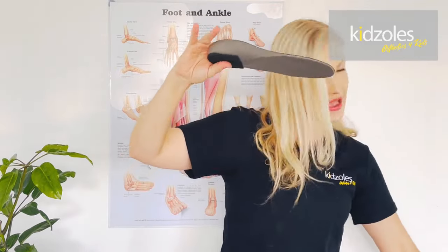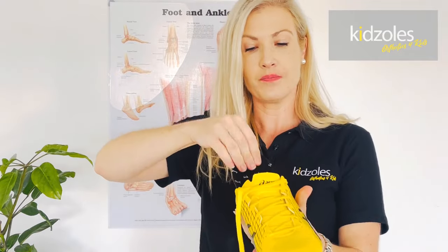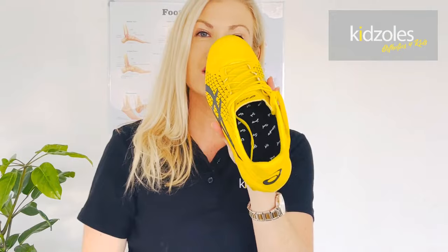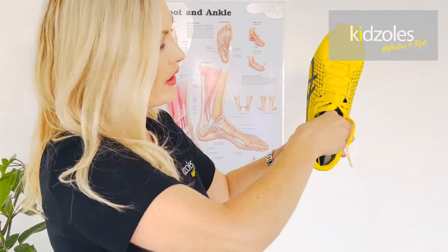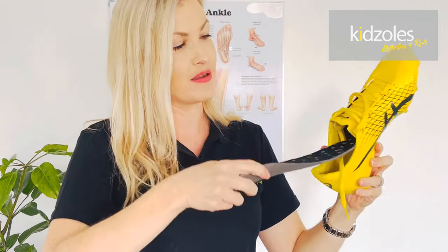With the heel raise added, chuck it in and just push it down in the center — you can see that it fits seamlessly into the shoe. The easiest way to tell your kids when they're swapping insoles between shoes is to grab it under the arch, as it will be easier to pull out.